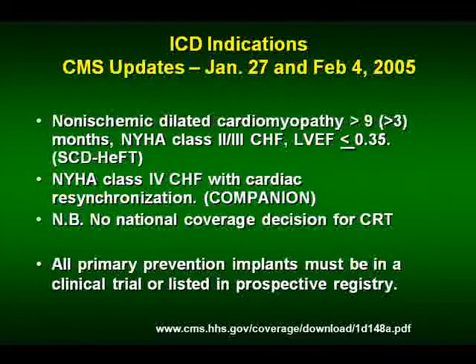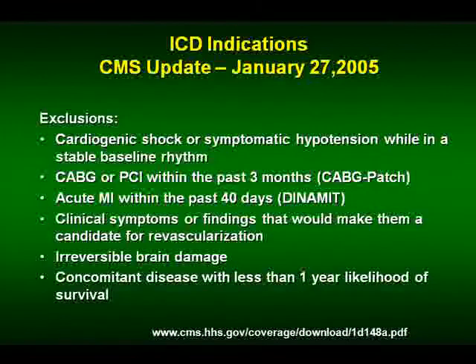And at the present time in the United States, if you put in primary prevention implants, they're being followed in a national database. When can't you or when should you not put an ICD in? Well, if somebody's in shock or is hypotensive in sinus rhythm, shocking them a few more times isn't going to help you.